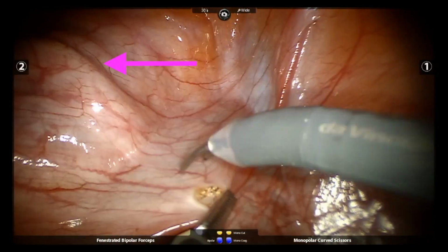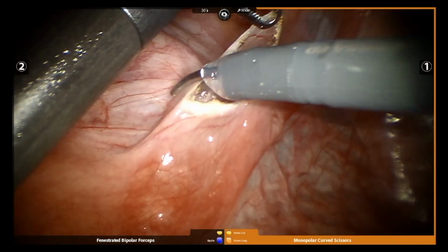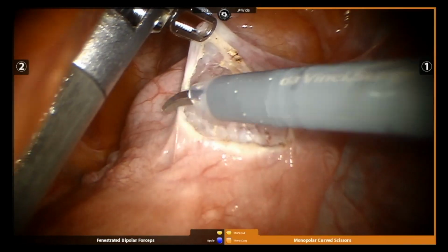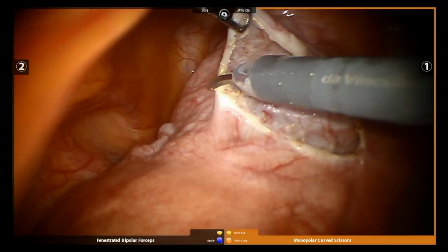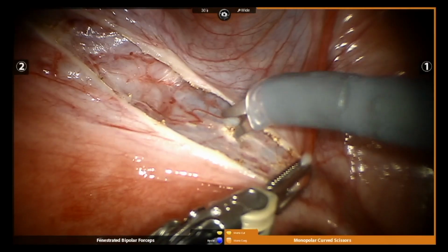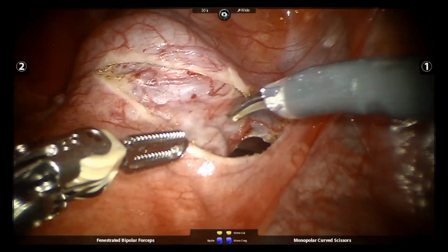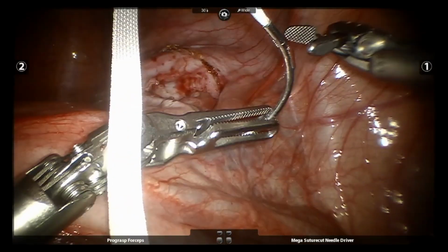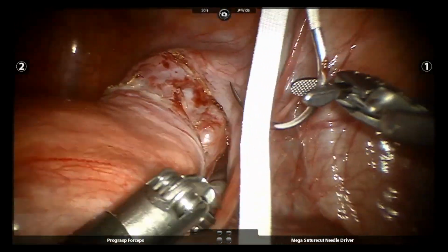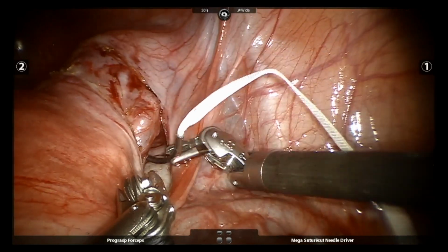You can see the delineation from the uterine manipulator, which assists the surgeon in making a bladder flap. Here, a tunnel is made through the posterior broad to better isolate and skeletonize the uterine arteries. The surgeon carefully avoids the uterine artery while passing the needle through the isthmus.